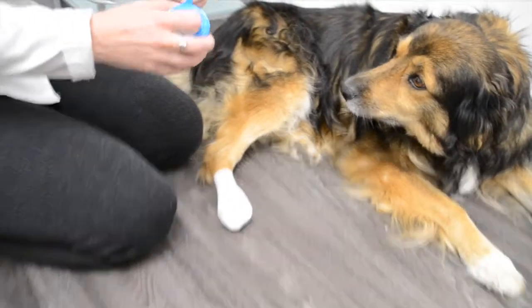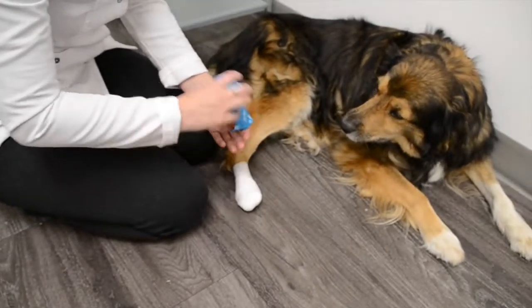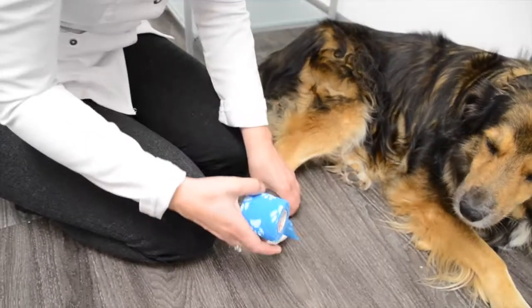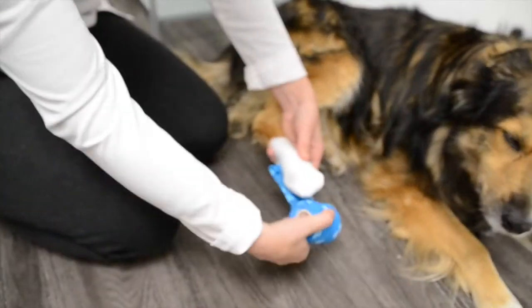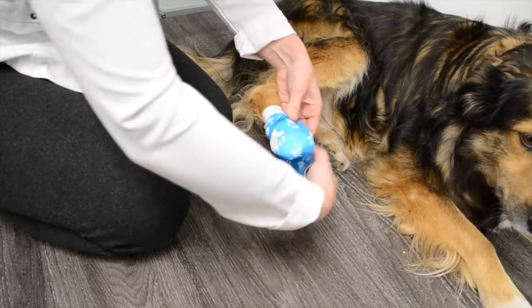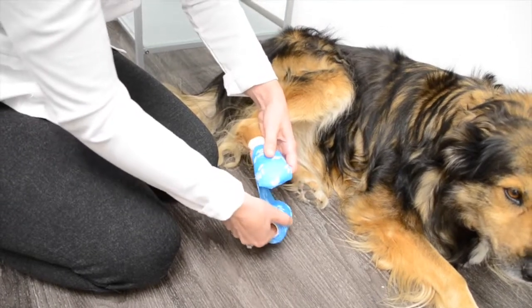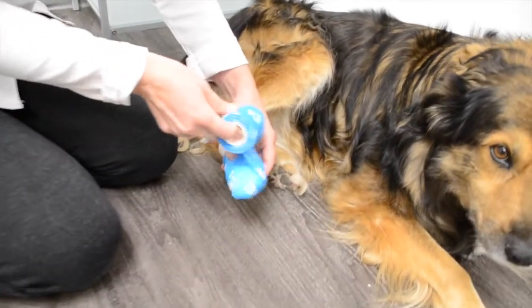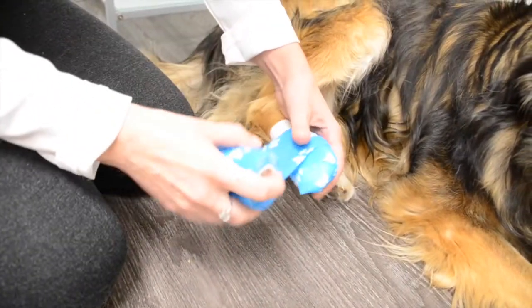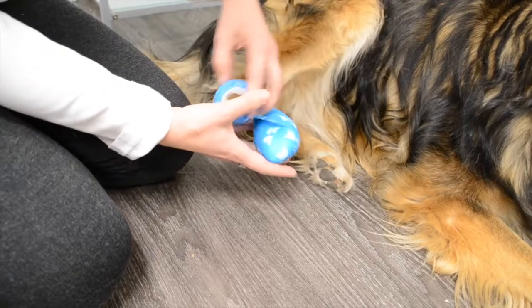Now, with the kling, we're going to do pretty much the exact same thing. So that's all folded on itself. You can start from the bottom or the top, it doesn't really matter. Now, I like to have my main roll on top. So we're going to do the same thing. You're going to have a line on the bottom. Let's fold that over. And then we're going to go around. So now it's stuck there. So now we can go ahead, and in this case, I'm just going to start going to the edge. And then we're going to go like that, up and over. Now I'm going to collect the other edge, like that, and go up and over.